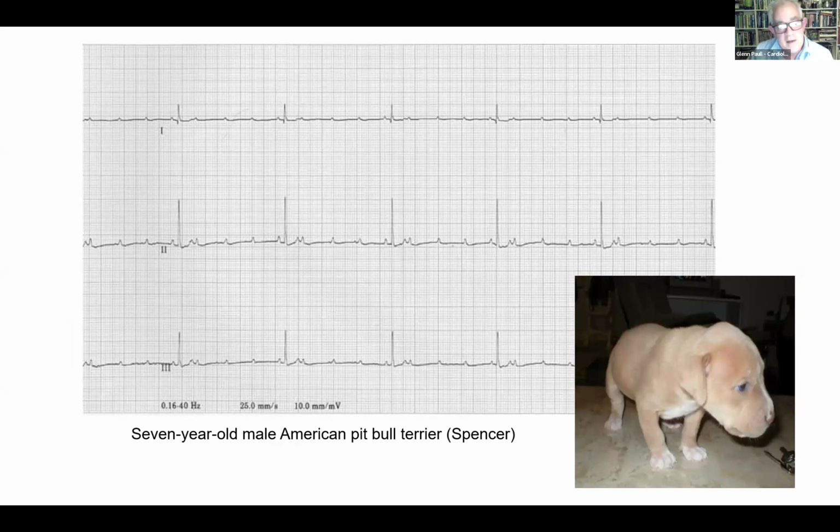So whenever we do an ECG, it's always good to say, look, they were having chest pain, or they're at rest, no pain, or they're experiencing palpitations. And if that context is put on the ECG, it just gives the reader a lot more information about the clinical context of what was happening whilst that ECG was being taken.